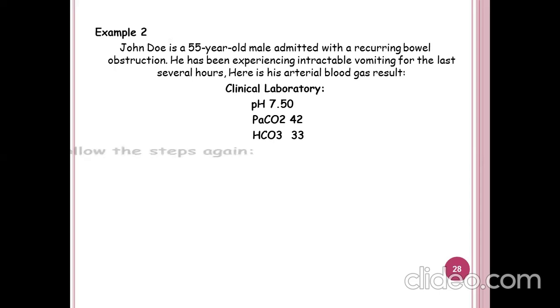So what is the problem here? Fast, tell me fast. What is the problem here? Alkalosis. Metabolic alkalosis.